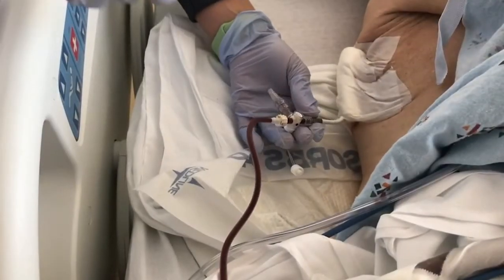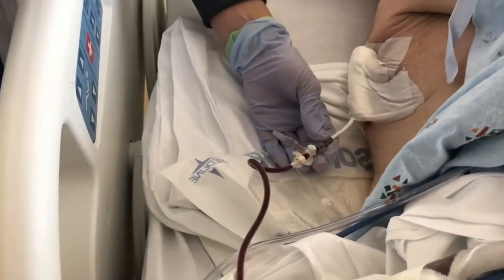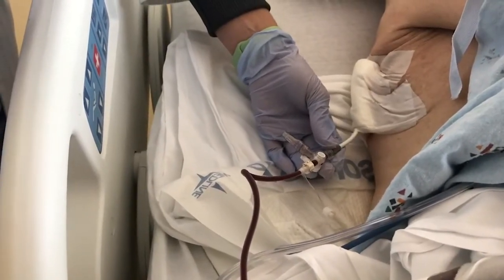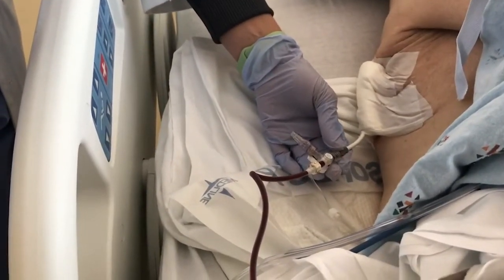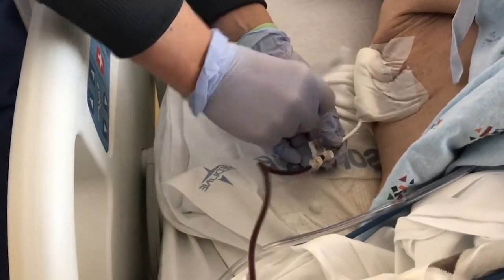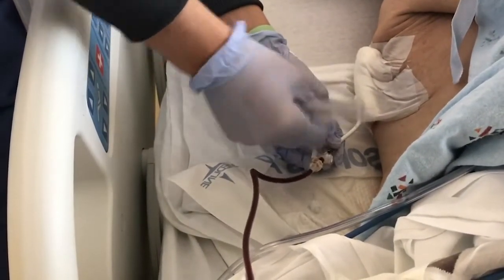We have the 14 French cook chest tube that we are going to use to instill some TPA and pulmozyme to try to break up a loculated effusion. The chest tube has already been inserted.